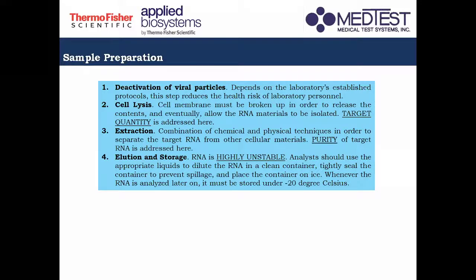This is to reduce or prevent the analyst from getting infected by the virus. So this depends on your laboratory, kung meron po kayong ganitong protocol or not.